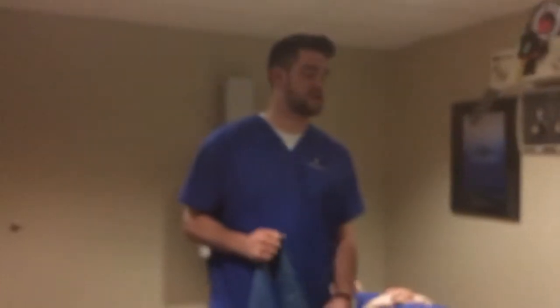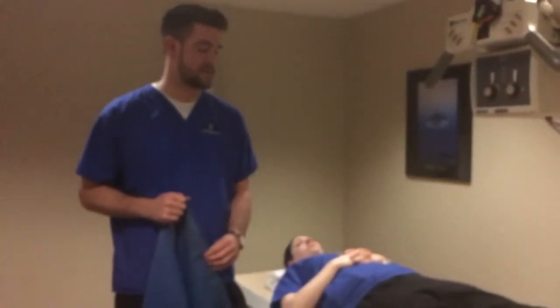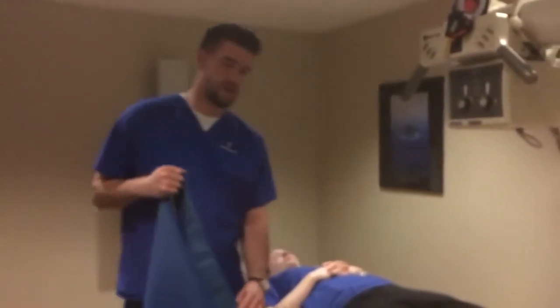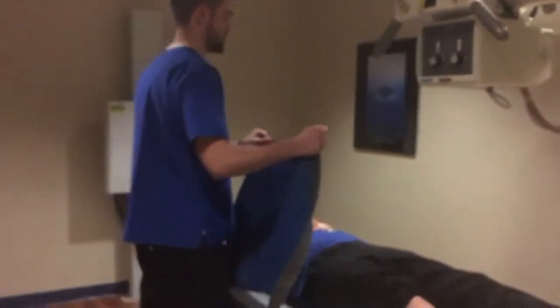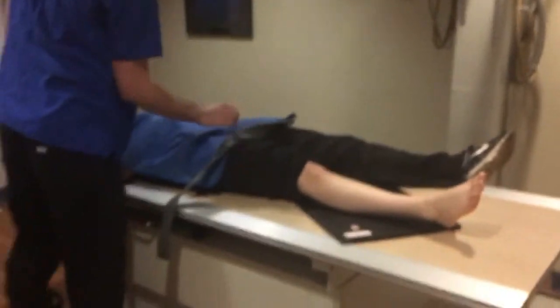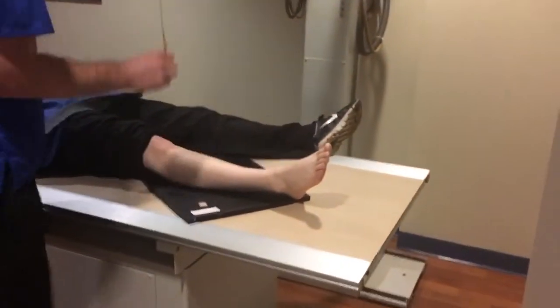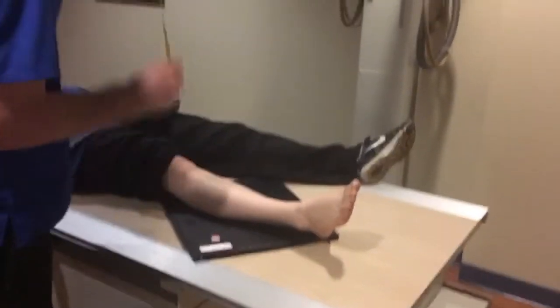For the AP projection, I'll be using a 14 by 17 inch image receptor at a 40 inch SID. First off, I will shield the patient, protecting their gonadal region, and check my SID, which is 40.